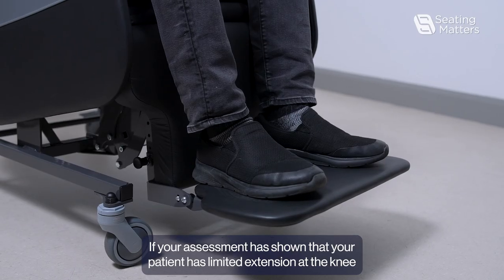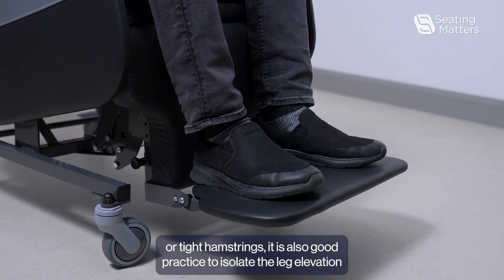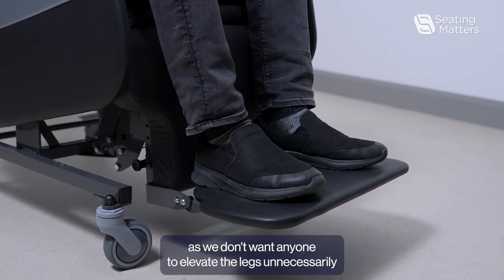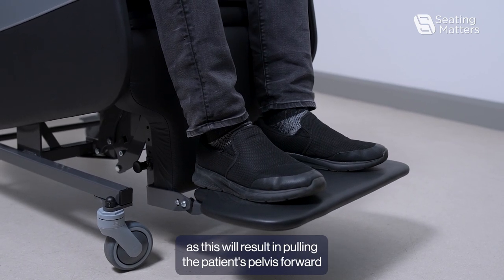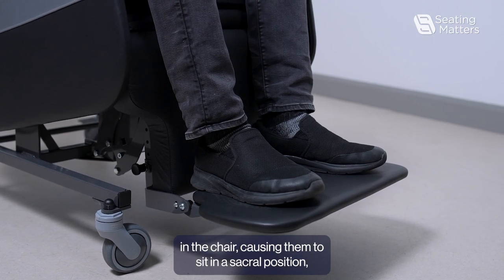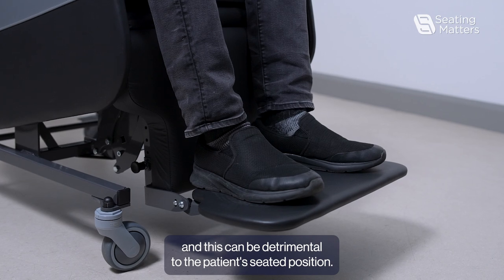If your assessment has shown that your patient has limited extension at the knee or tight hamstrings, it is also good practice to isolate the leg elevation, as we don't want anyone to elevate the legs unnecessarily, as this will result in pulling the patient's pelvis forward in the chair, causing them to sit in a sacral position, and this can be detrimental to the patient's seated position.